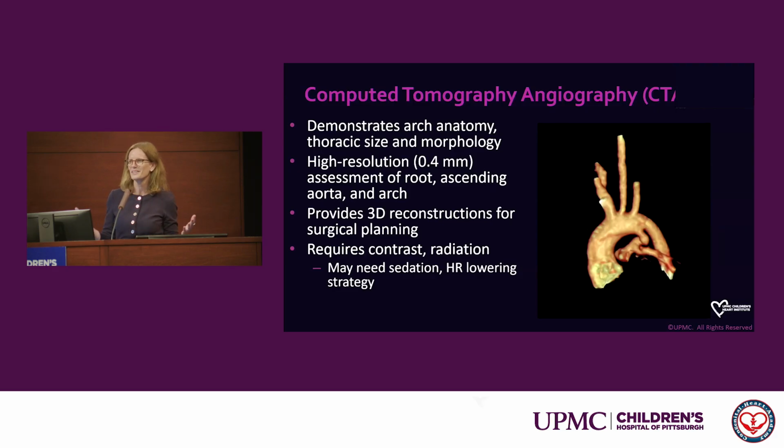It's hard to summarize this all in one slide or a few bullet points, because the fact of the matter is there has been, for lack of a better phrase, a disruptive technology change in CT with the advent of photon counting CT scanners, which have greatly reduced CT dose and given us incredible capability to get these really exquisite pictures and not really cost a lot of radiation at all. And so now there's a wide range of CT scanners available.